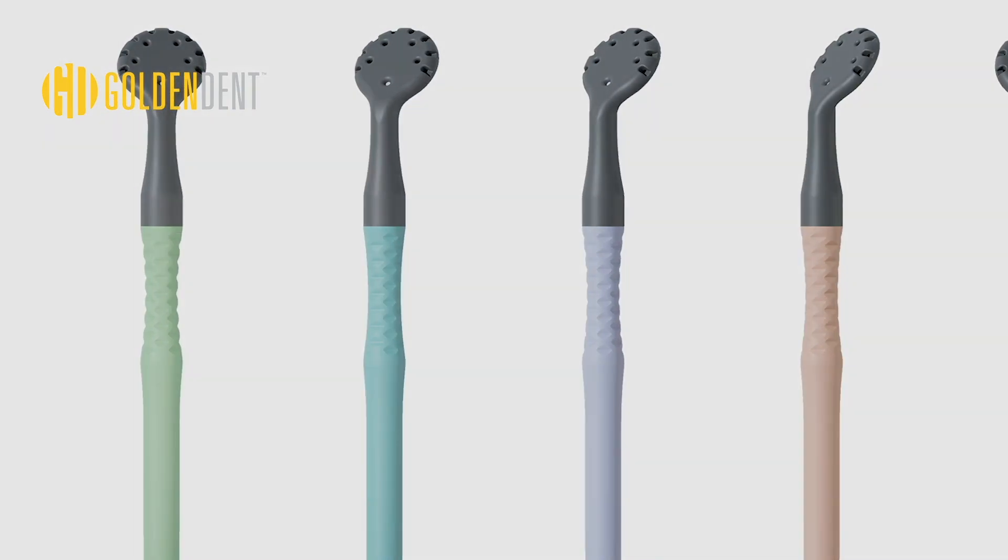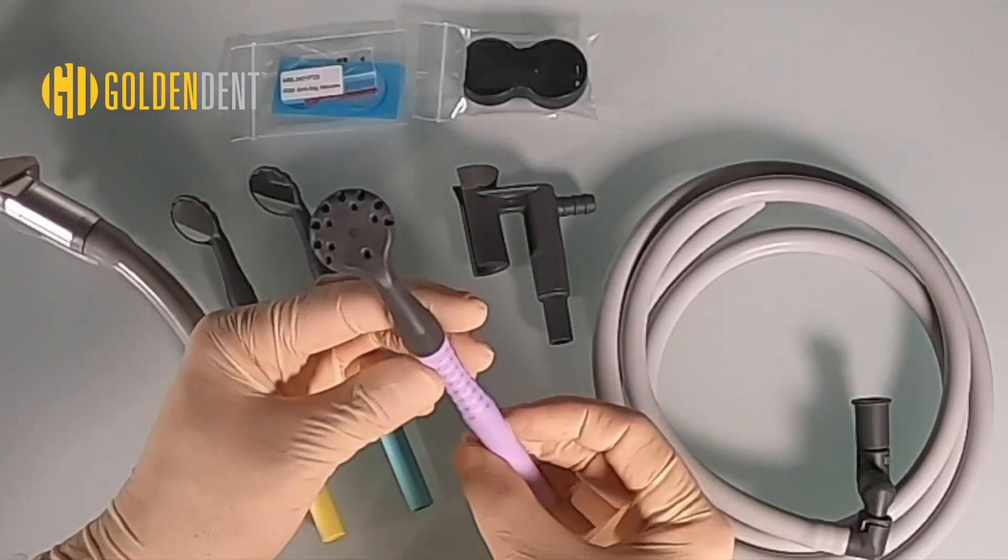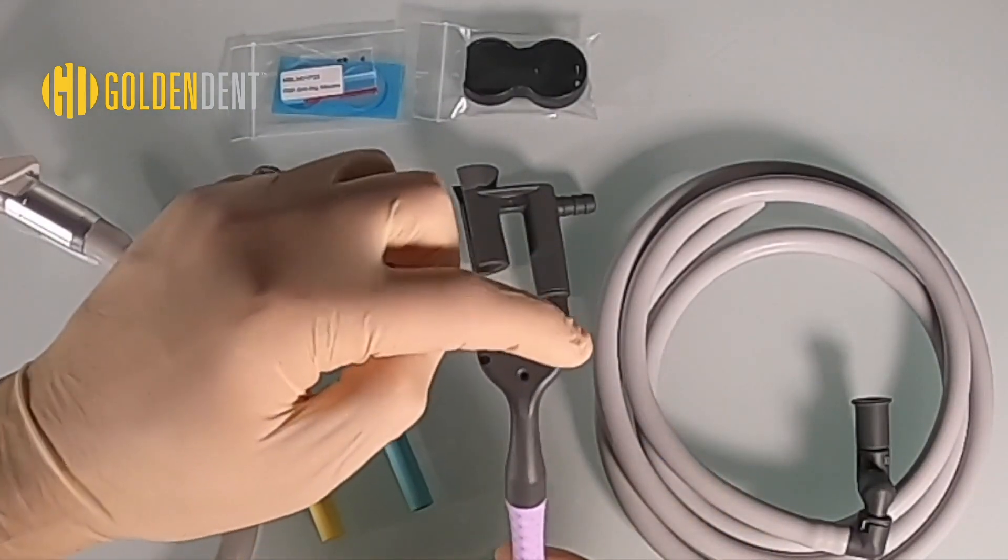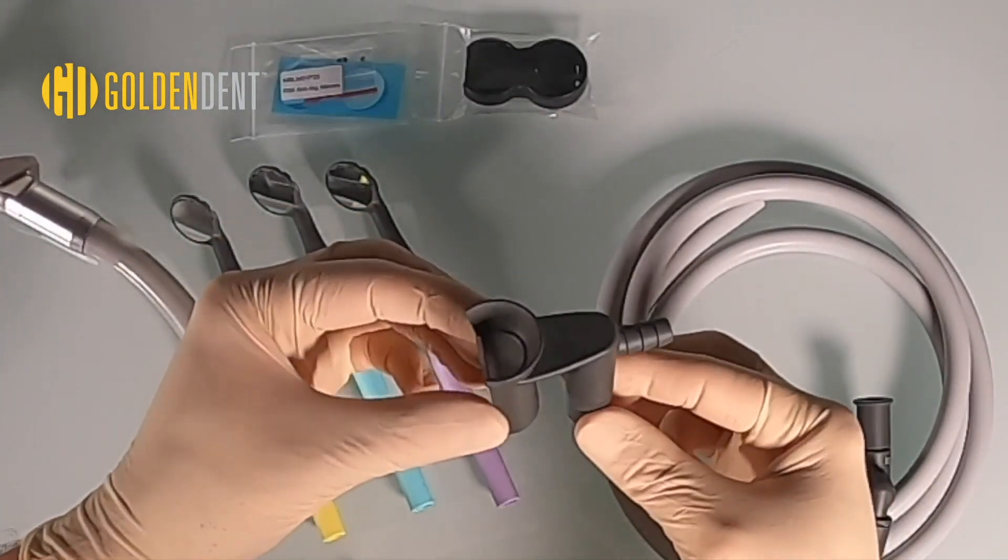This is our M7 HVE suction mirror. It comes in a variety of fun colors. The M7 mirror has 20 suction holes spread over the back and encircling the front of the lens, providing powerful and quick evacuation.